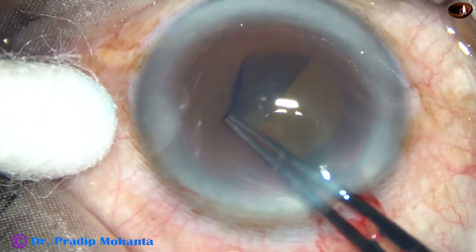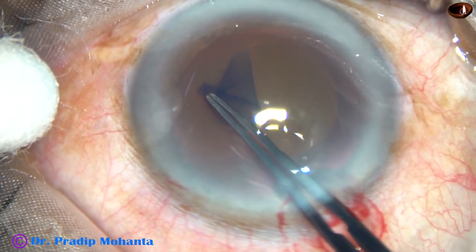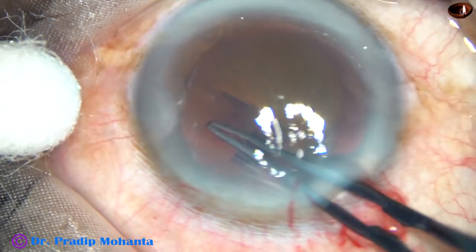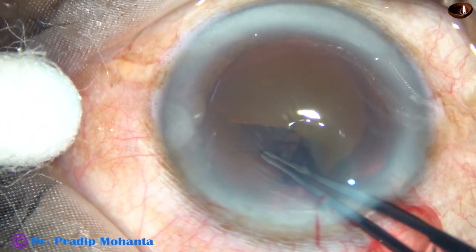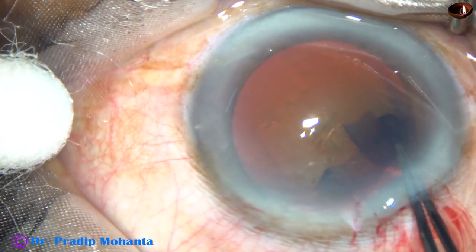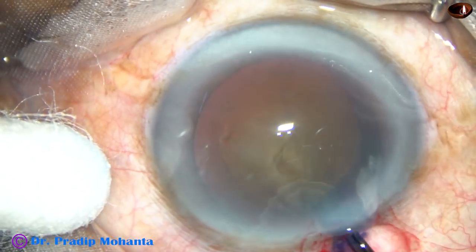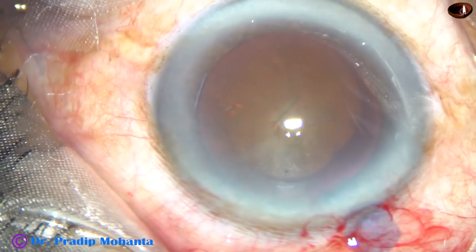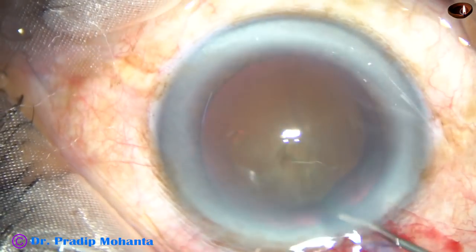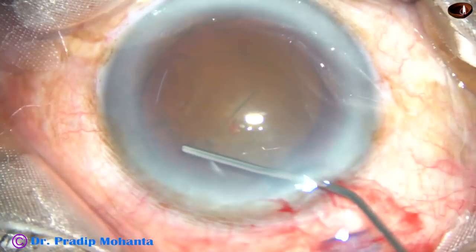Going anticlockwise, trying to do an adequately sized rhexis. The rhexis is becoming small, so I go to the periphery to complete it. Though it is not a circular rhexis, it is an adequate sized rhexis.